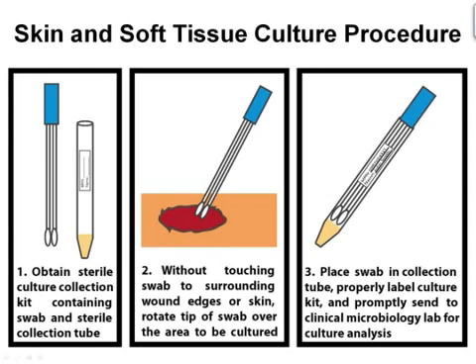Blood cultures are frequently positive in invasive wound infections. A wound that is red, painful, swollen, and draining pus is probably infected, and a skin and soft tissue culture should be performed. The procedure is outlined here. Firstly, the sterile culture collection kit must be obtained. This kit typically contains a swab and a sterile collection tube.